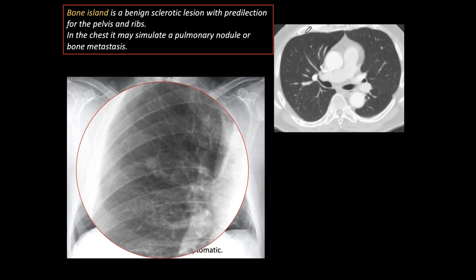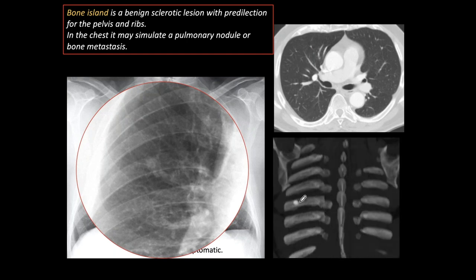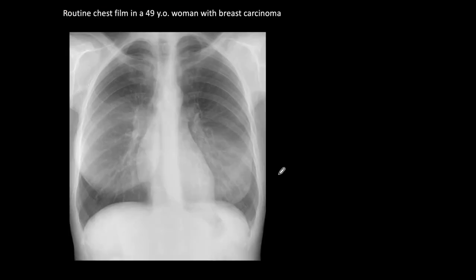When we do CT we don't see any abnormality in the chest in this area — no nodule. However, we see a small calcified sclerotic lesion, and in the coronal reconstruction it is obvious that it is a bone island in the seventh right rib. That is the typical appearance of the bone island. It can be suspected on plain film, and if not confirmed, CT is needed — and we have to think of that.